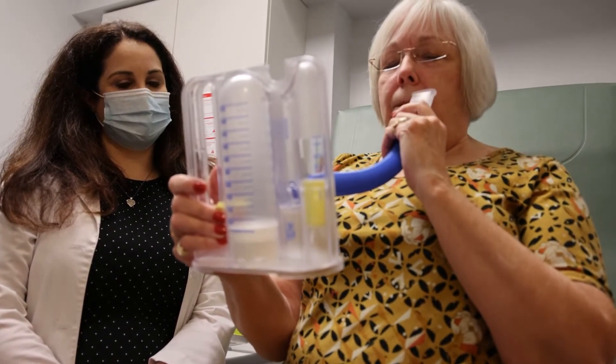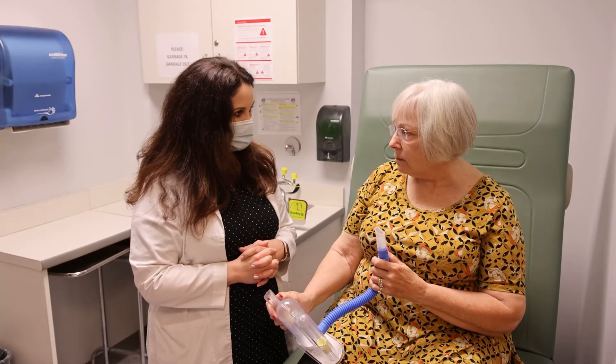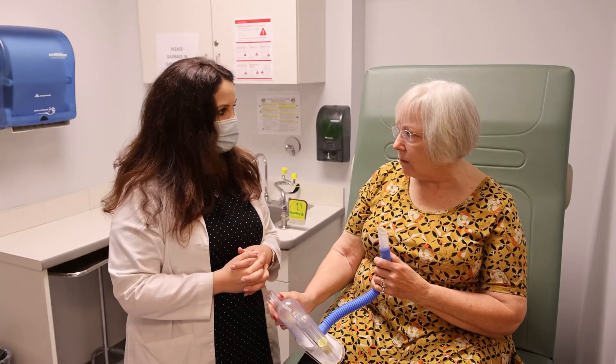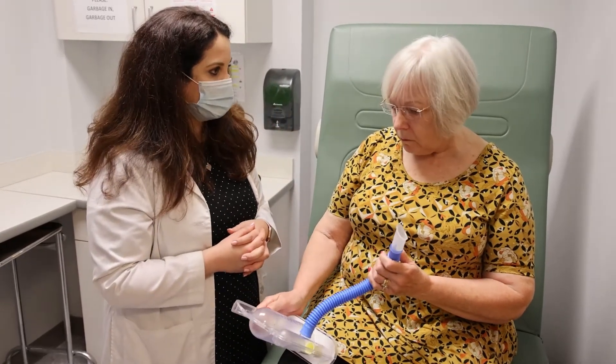What you don't want to see is that yellow valve shoot quickly to the top. Remember that this is an exercise, so it's important to pace yourself. Each breath should take about four to five seconds, and then you'll want to give yourself a rest in between. If you continue to do this with the correct technique, you'll likely see an improvement in your lung volumes.